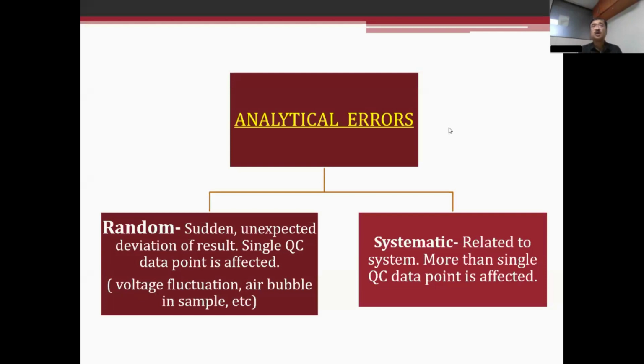So that is called a systemic error. A systemic error you may also call a bias, and that is part of a QC rule. You know the LJ chart we prepare. You know the Westgard multi-QC rules. These are the rules where you can find the systemic errors or the bias. Just in a nutshell, I am giving you the quality control process so that you can understand the systemic error concept.